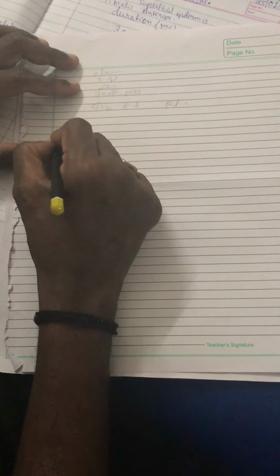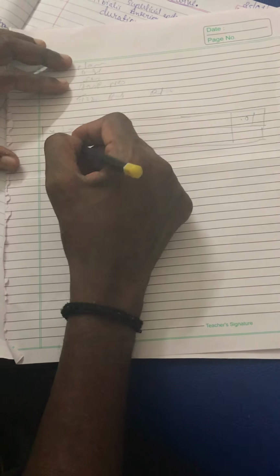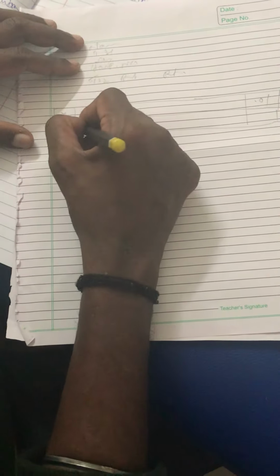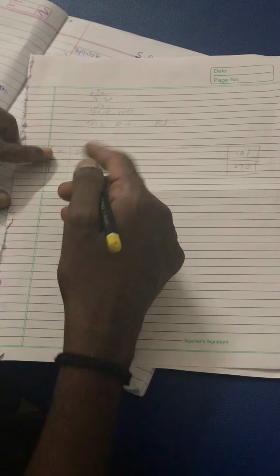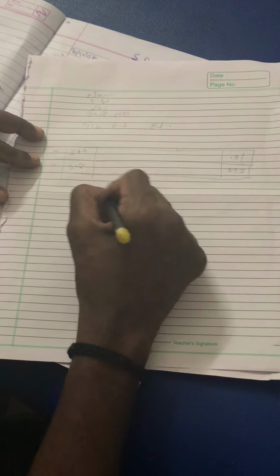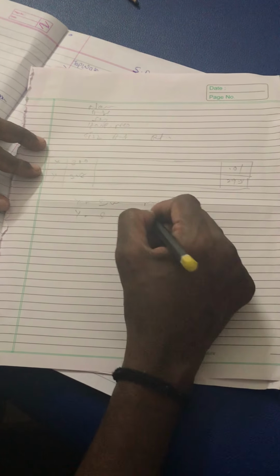And what I'm going to do is make a table, like in normal mathematics. I'm going to write the x-axis and y-axis values, starting from 300 to 0.01. At 300 we required 3.8, and this is somewhere around 29.5. So I'll write down all the values. The x-axis is duration in milliseconds, and the y-axis is intensity in milliamperes.